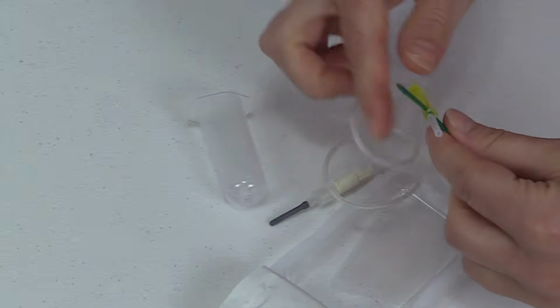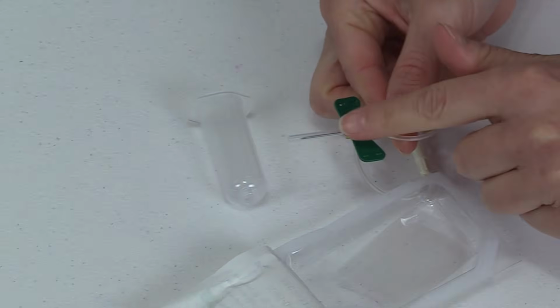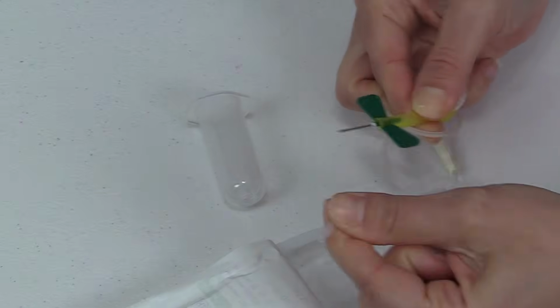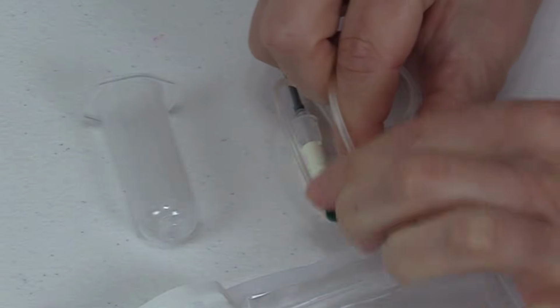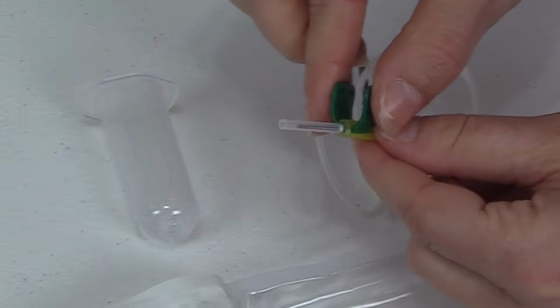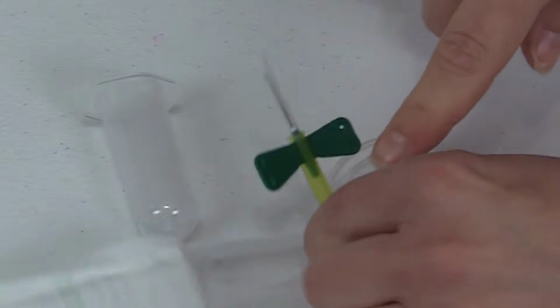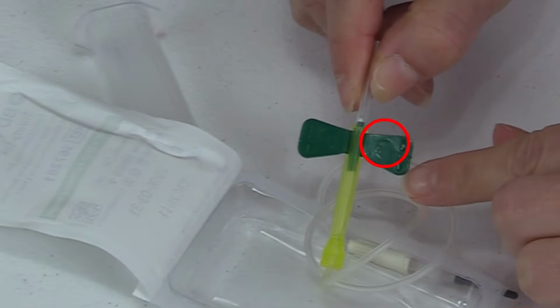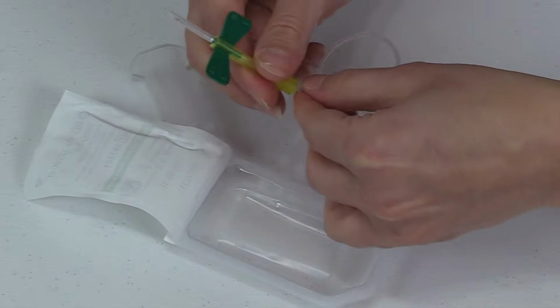Okay, right here, you have this little sheath part. This is protecting your needle. You take this off whenever you're actually ready to use it. And here you have textured sides of your wings. These are the sides you're actually going to hold whenever you're going to stick the patient. And then on the top, you will have a little number that has what gauge you're using. Here it says 21. Now, connected to this is some tubing.